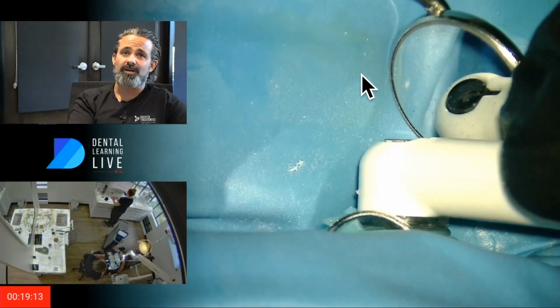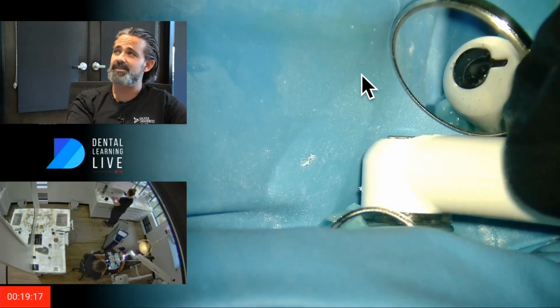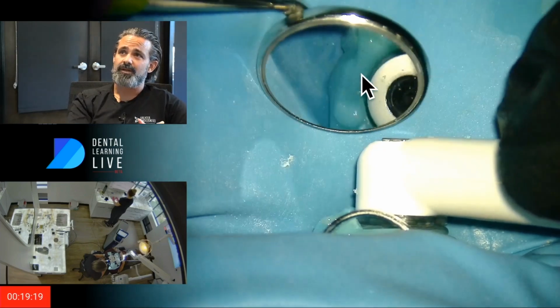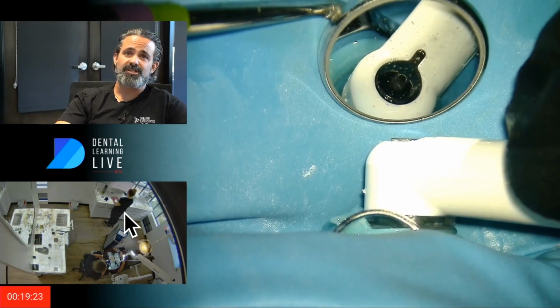But I tend to hold them. I used to let them hold it, but then I kind of got obsessed with trying to master this thing, and so I hold it all the time. You can see Lindsay up in the corner up here, and she's actually typing my notes.